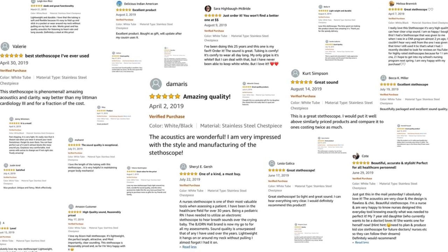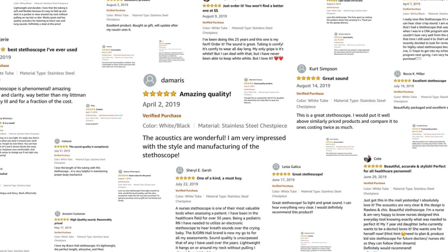Acoustics wise, this is a five stars out of five. It is on par or even better than the Littmann Classic 3. But don't take my word for it — go and check out the reviews on Amazon, they will speak for themselves.